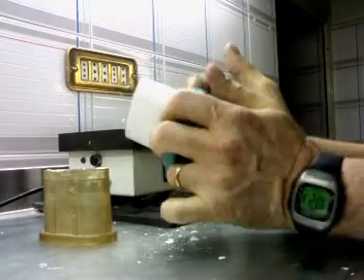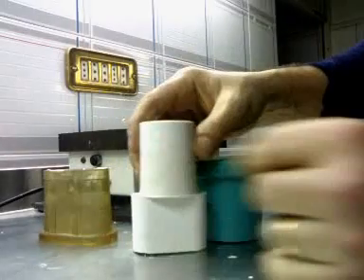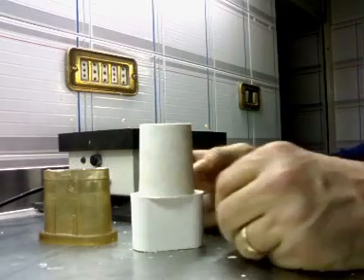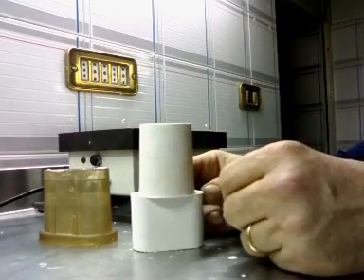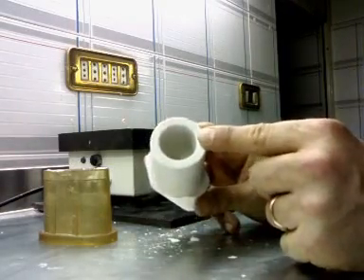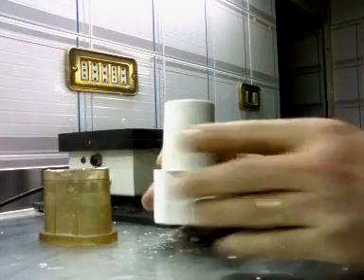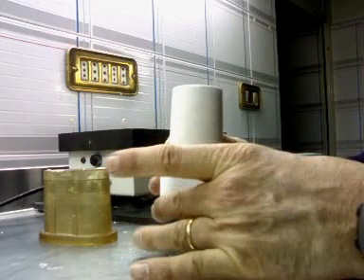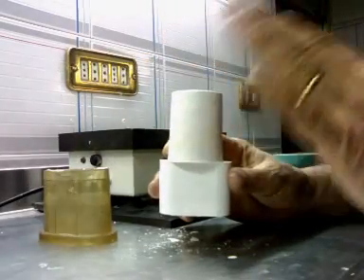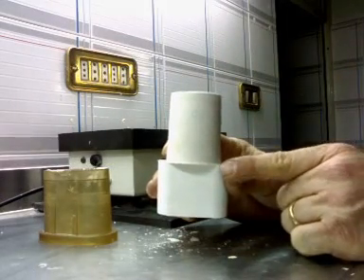Here we got the crucible. Here we have what we call our investment once it's hardened — it's a phosphate investment. In here we will be putting our metal, so this will be the crucible. This is our ringless. Anybody can do a ringless cast, but having a casting that is ringless with an incorporated crucible — this is another deal. Not everybody can do this. And this was made special, using our metals and having them fused with this system.